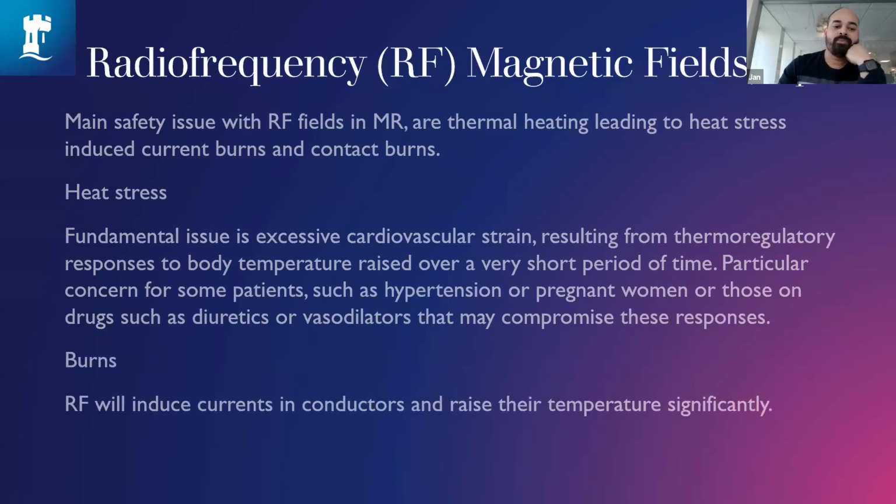Burns: RF will induce currents in conductors and raise the temperature significantly. So you should be really careful when you place them. I've had a similar situation where we had a patient who was taken into the scanner, and we had the fiber optics running over the top of her tummy. After the scan, we noticed that there were burns there. Even though the cable itself didn't have anything metallic, for some reason it caused a burn.